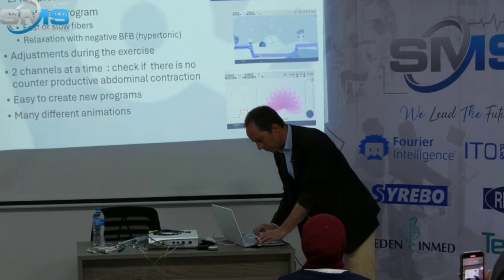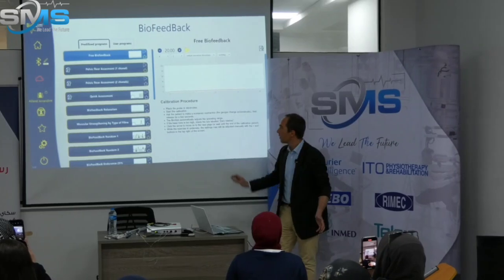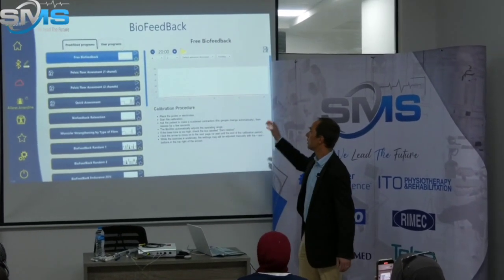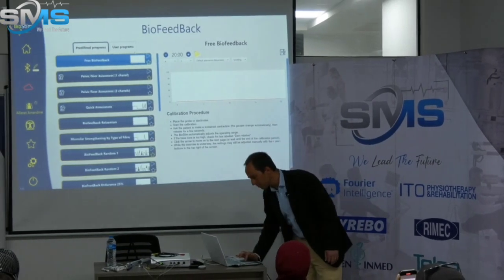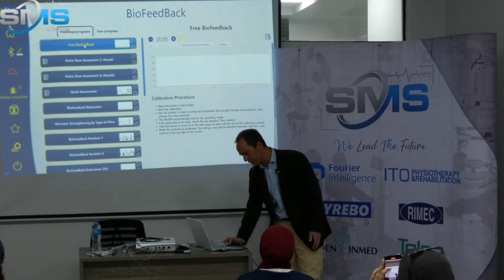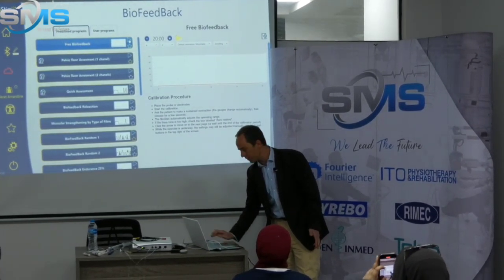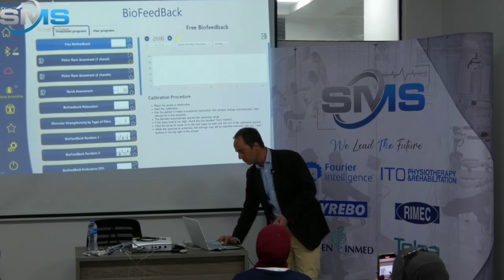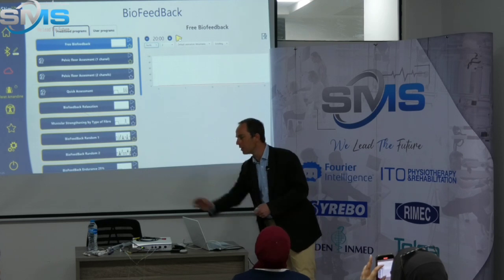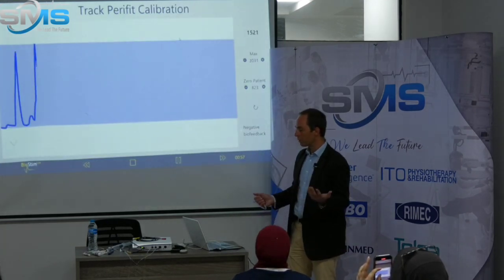I'll show it back to the screen. Okay, so I'll show you how it works here. It's a little like the same we had just a minute ago with stimulation, but here, now it's the patient to work. So first exercise you have to do with your patient is to make sure she understands how to contract her muscle. So we'll start here. Again, I'm testing with this one, but it would work the same with classical probes, just easier. So you ask your patient to contract and relax.